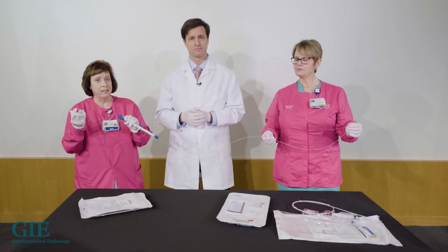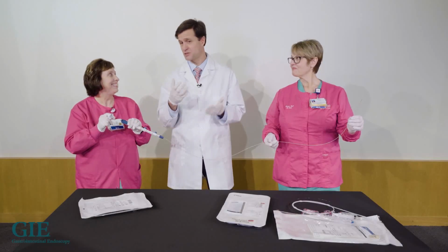Right, so it's just like any other when you're doing biopsies. When he tells you to close, you close, and you can feel if you got some tissue. The first time I used it, I told Dr. Taylor, I don't think we got anything, and sure enough, we didn't. So when we went back down, I said, oh, I've got something. And he could also feel that. So when we pulled it out, we did have our little microbiopsy. And you have a piece of tissue, yes, which is great.